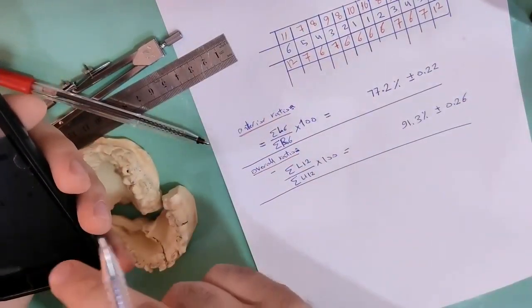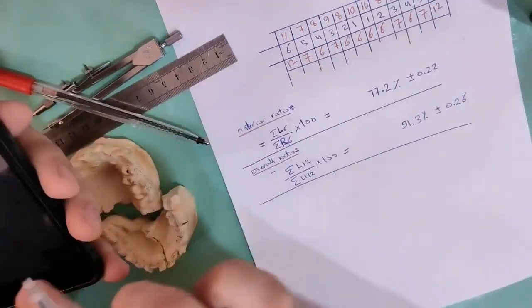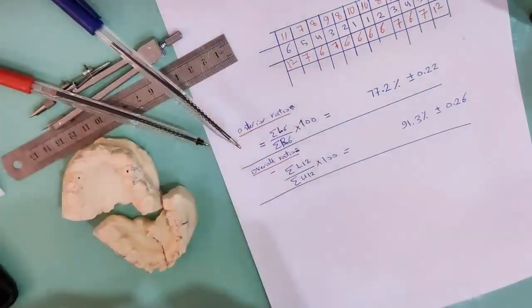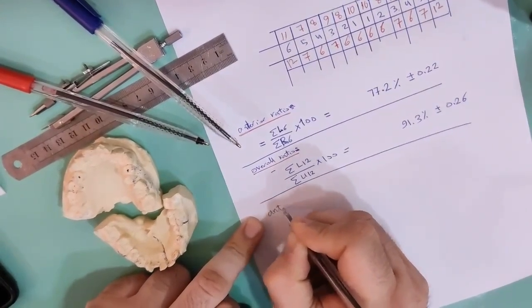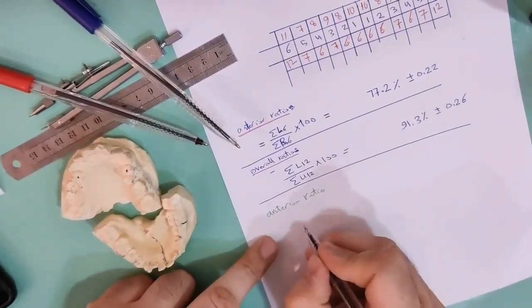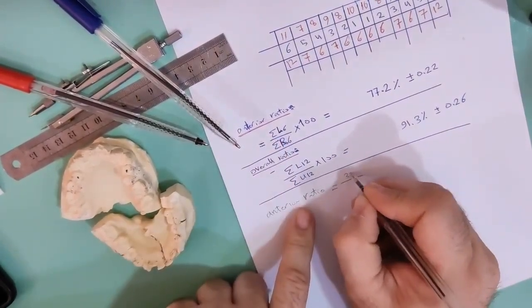Six plus seven plus seven equals 38. So for this patient, the sum of lower 6 is 38.